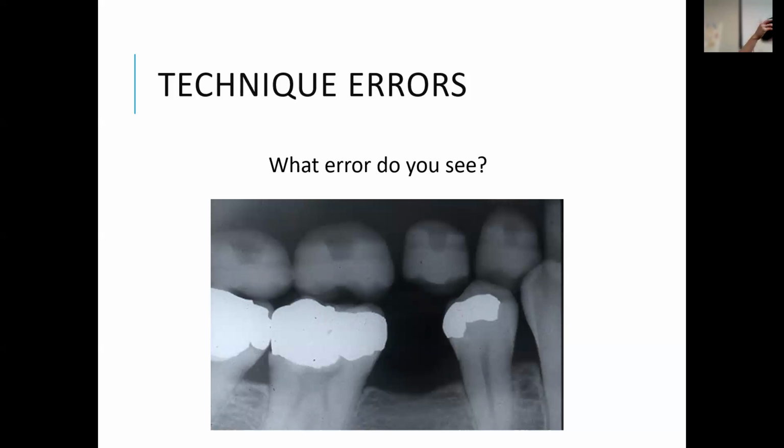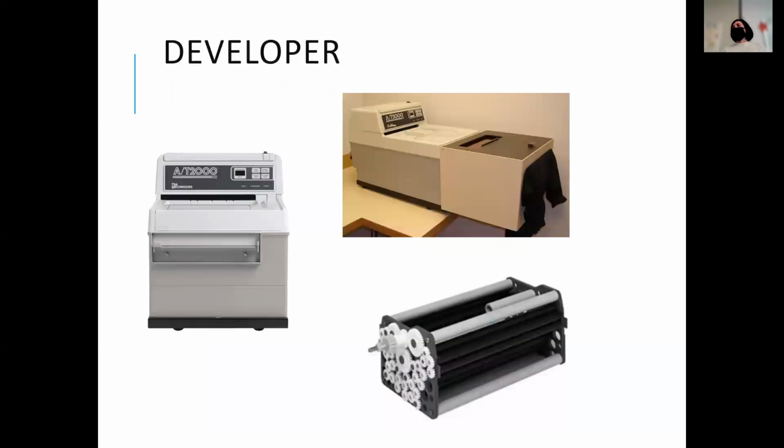So you still end up sometimes with not getting it seated low enough to get the apices. A lot of times we'll put a bunch of cotton rolls or something to try and get it to seat. That might have been what they were trying to do here, give them something to bite against, and that might have been why they left the denture in, or maybe it's just a mistake. I don't know. Kind of funny.